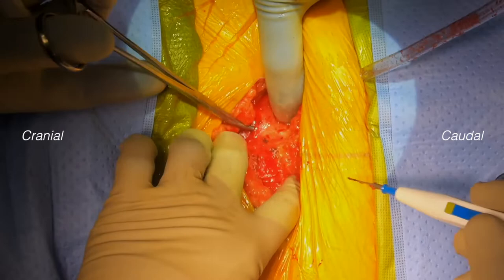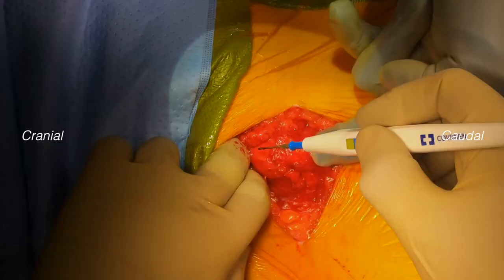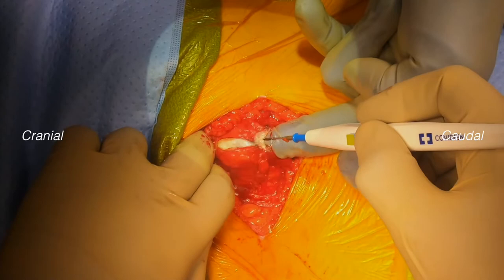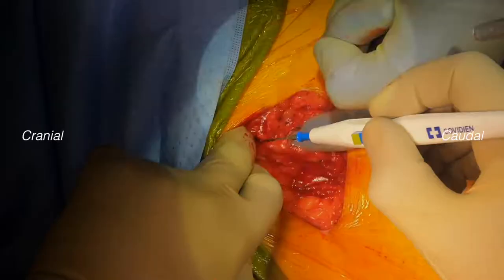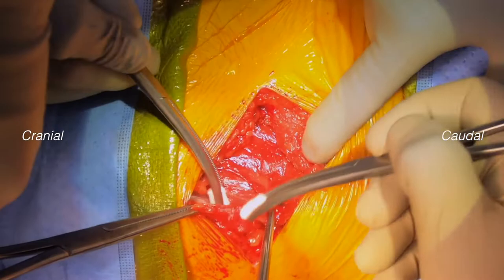After making a small hole in the anterior rectus sheath directly in the middle of the left rectus muscle, we incise longitudinally the rectus sheath both cranially and caudally. The anterior rectus sheath muscle is visualized, and we then tunnel back to midline to retract the left rectus muscle to the left.